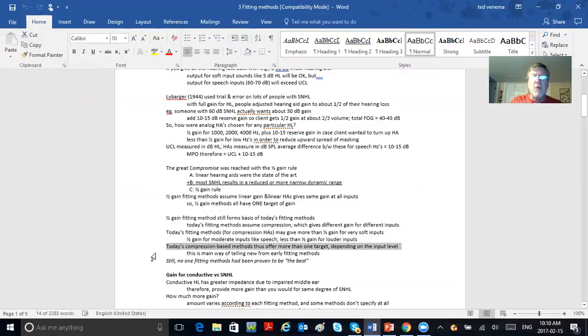This is the main way of telling new from early hearing aid fitting methods. And still today, no one fitting method has been proven to be the best.